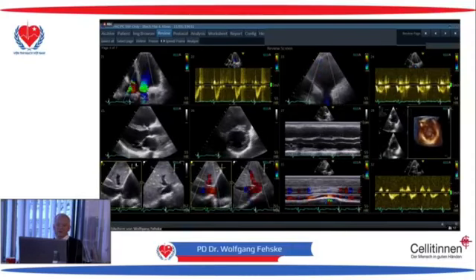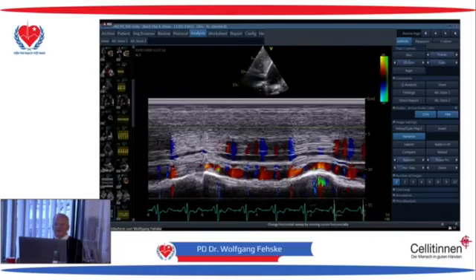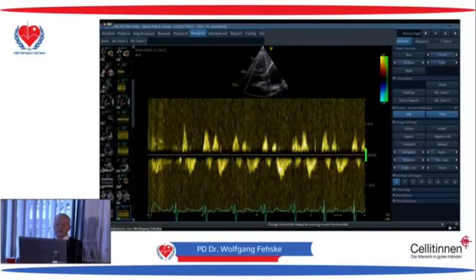All you know that, and these are a little bit dilated, and what we do then is that we are looking for respiration changes in the color mode in the liver veins, and you see that there is only diastolic, but there is always a backward flow, which is somewhat in some kind still controlled, and we look for the regurgitation flow in the liver veins, and this is characteristic.